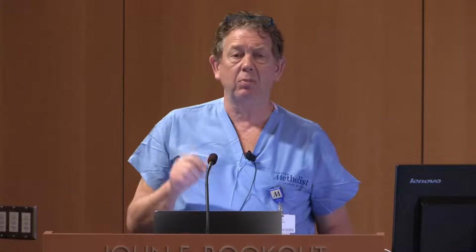Yeah. The KMP, which is what everybody refers to, I think has a little shorter stem on it than the Berenstein. And there can be some advantage, particularly when you're in small blood vessels. If you have a long stem on the angle, then sometimes you just can't spin it as much as you want. Yeah. I usually start retrograde. That's just me. I'll start in a common femoral, take a glide wire, and work back. I hit a stenosis.